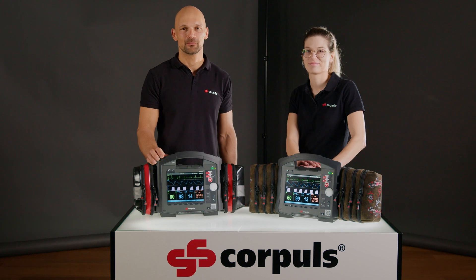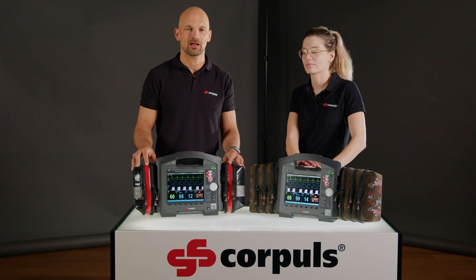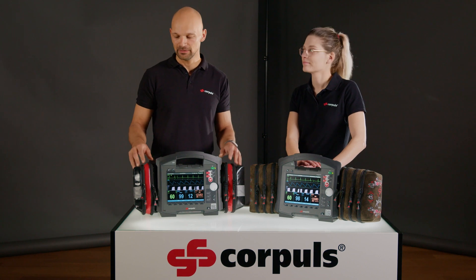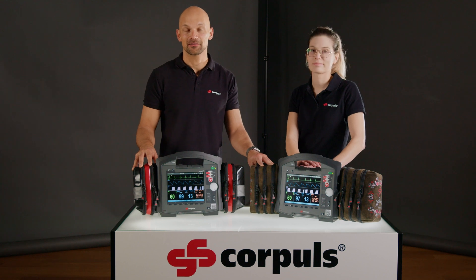Welcome to a new YouTube video. This time we want to show you how we pack the Corpus 3T bags and how to correctly handle the cables. Here we have the XL bag variant and this is the XXL bag variant in the Bavaria Special Edition.